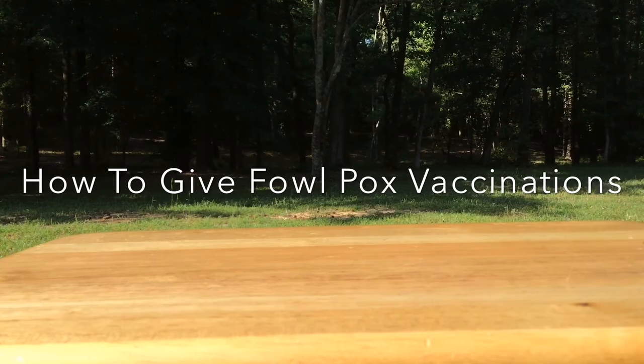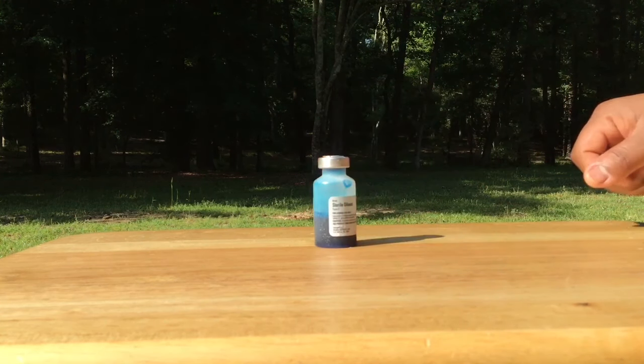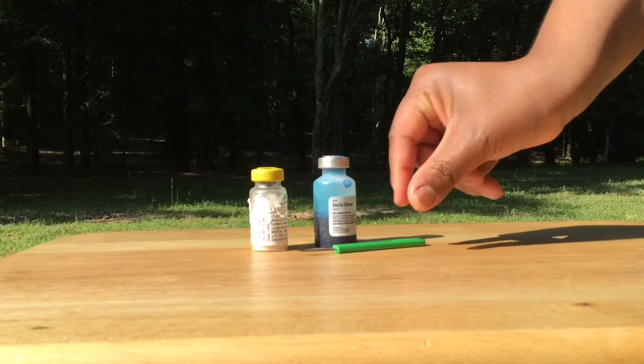This video will explain how to perform the fowlpox vaccination in order to help you keep your flock healthy. When you buy fowlpox vaccine, it usually arrives with a bottle of diluent, the live vaccine, and the applicator stick.